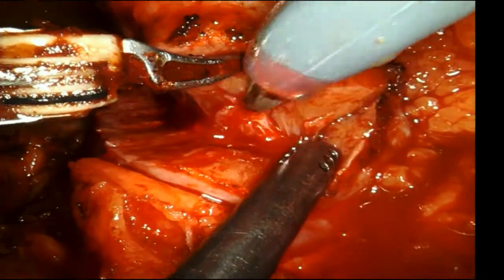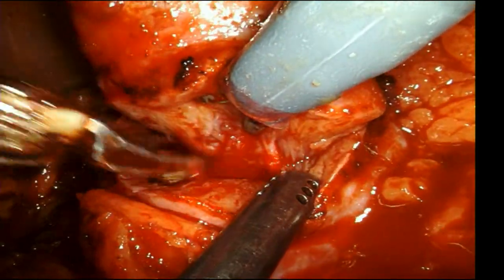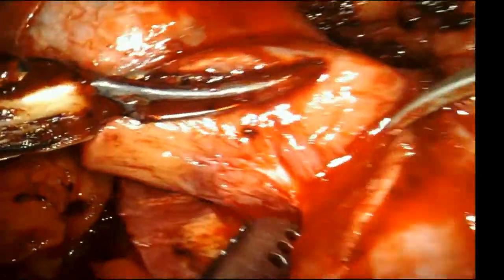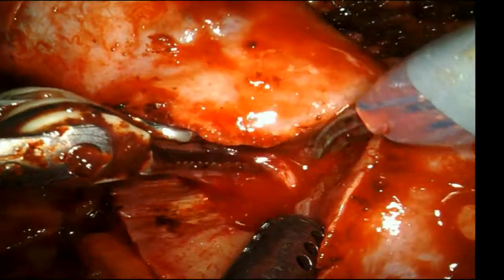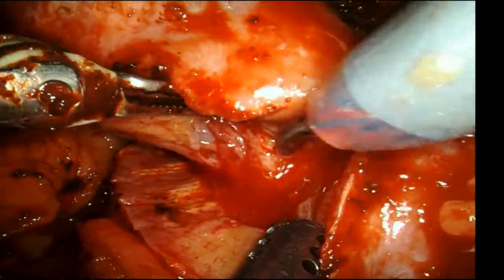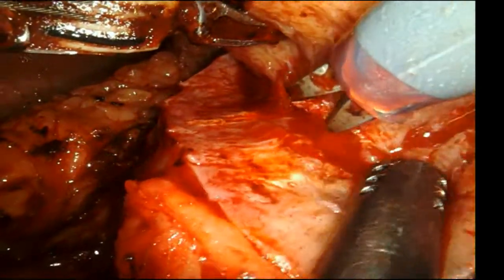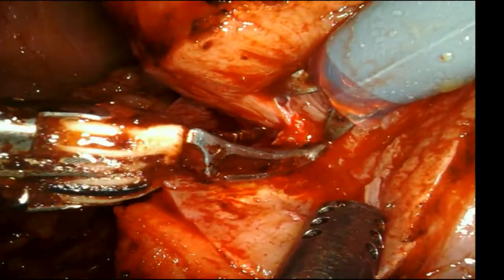And then we're going to go all the way down to the sinus fat. That was our landmark that we saw in our scan. So until we see sinus fat, we're not going to make our turn. And if we get into the collecting system, it's okay, because we're very lateral on the kidney, so we're not going to make any orphan calyces. An artery right here.